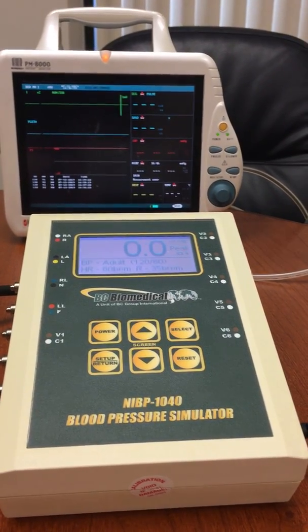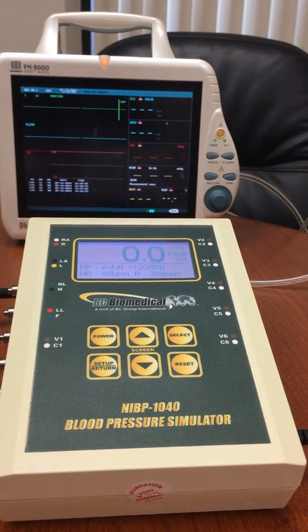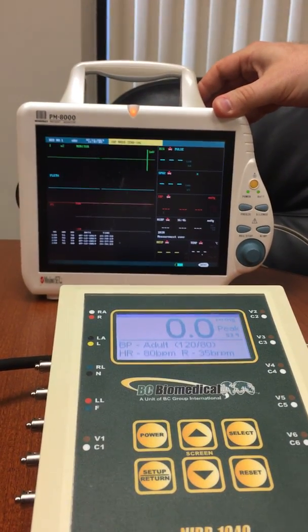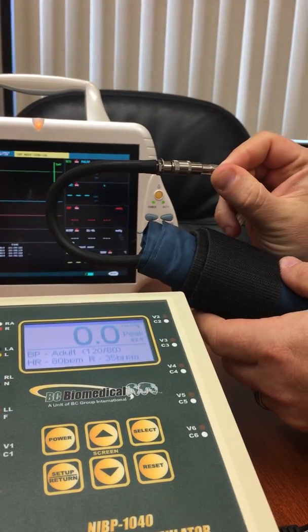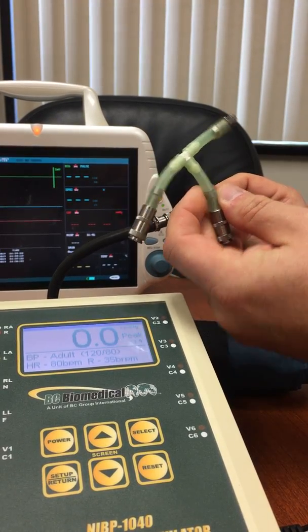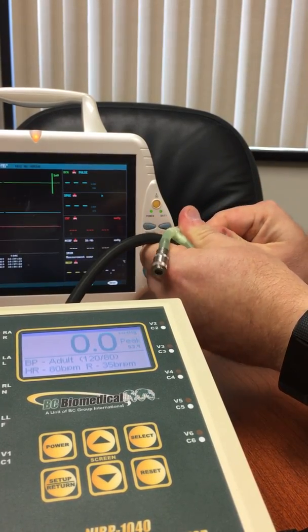In this video we're going to be talking about the NIBP-1040 and how to perform an NIBP simulation. In the background we've got our Mindray PM-8000, and this monitor comes with the standard blood pressure cuff and the quick connect fitting. With our NIBP we received this T, and what we're going to do is disconnect the blood pressure cuff and put this T in series with it.